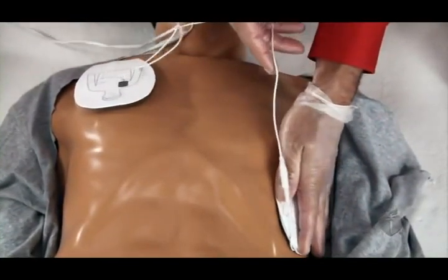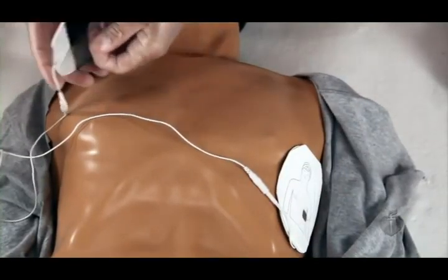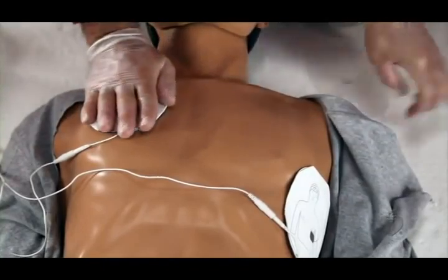Place one pad to the side of the left nipple. Place the other pad on the victim's upper right chest, directly below the collarbone. If instructed by the AED, clear the victim and analyze the rhythm.